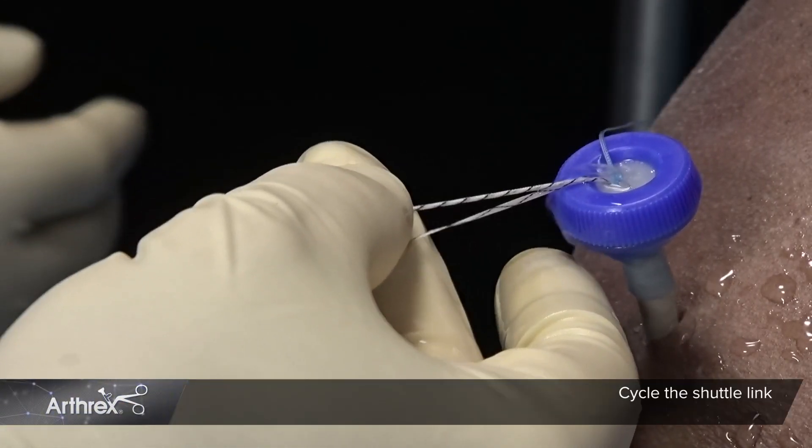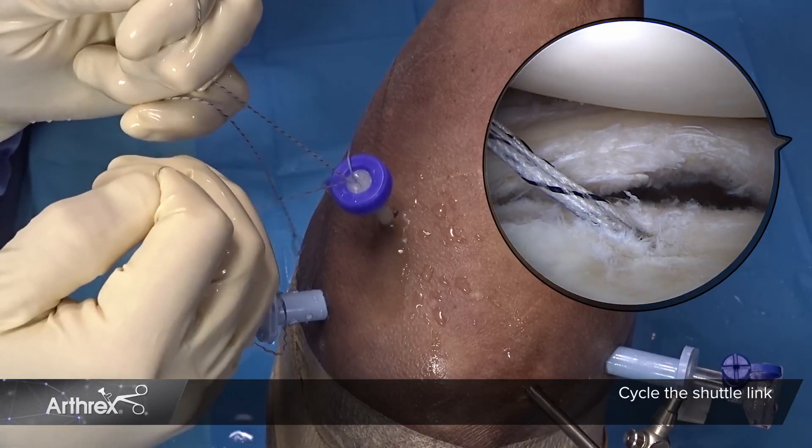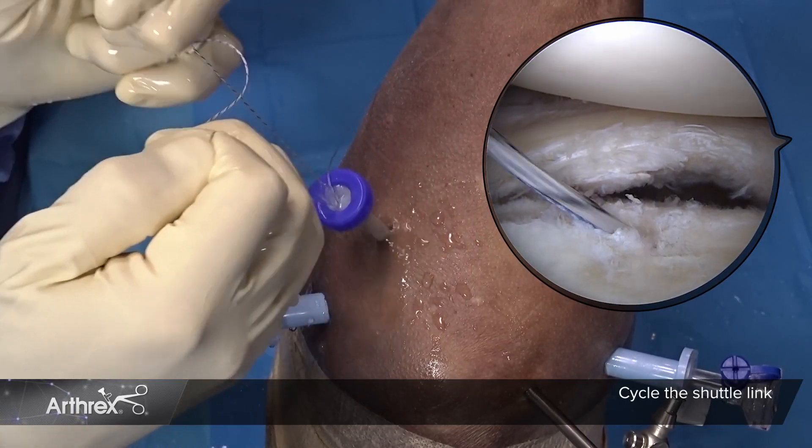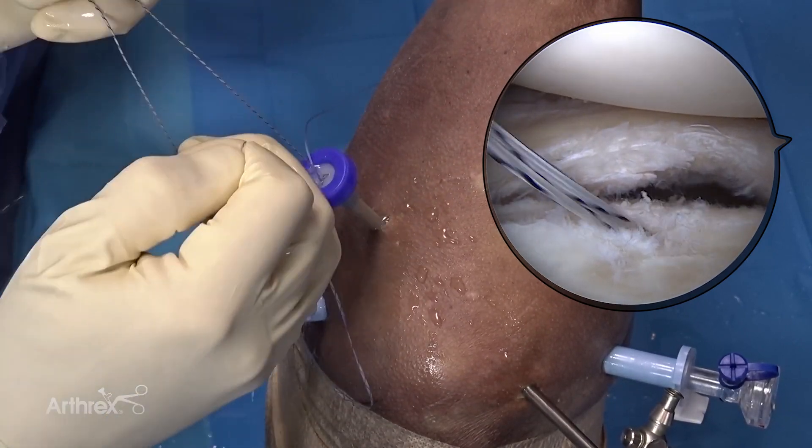Before you shuttle your repair stitch, I recommend cycling the shuttle link through the anchor to ensure all bone and soft tissue is removed from the socket, and to confirm that the shuttle link slides easily without tension.